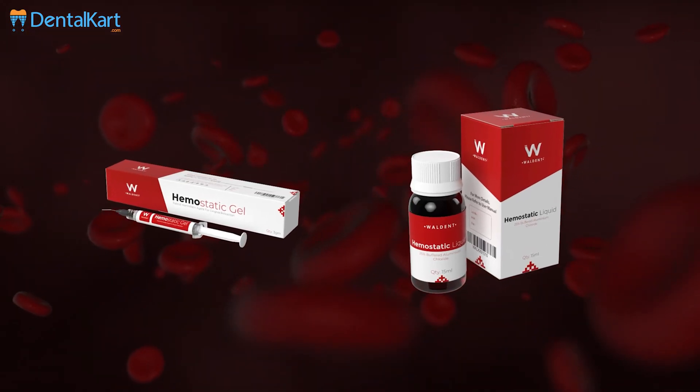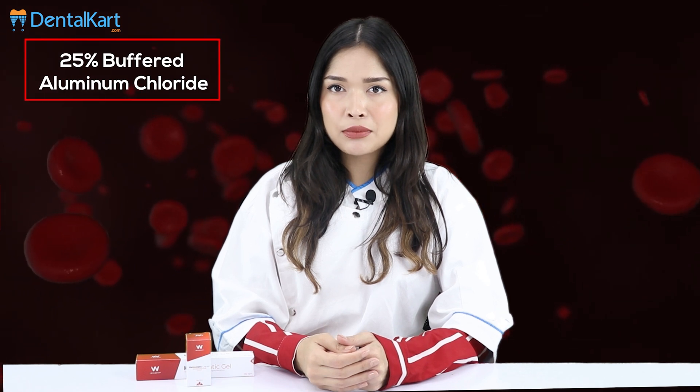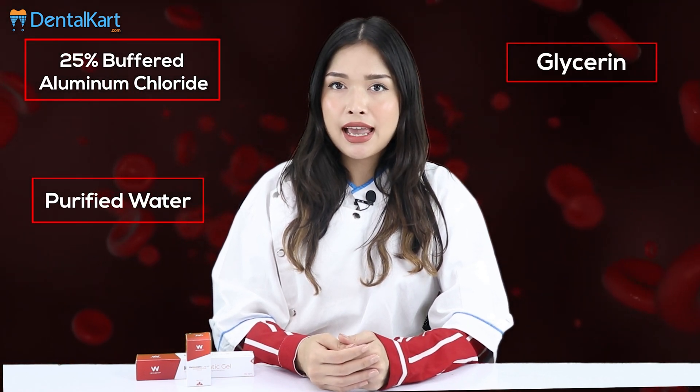Walden hemostatic gel and liquid is composed of 25 percent buffered aluminium chloride, purified water, glycerin, and excipients.